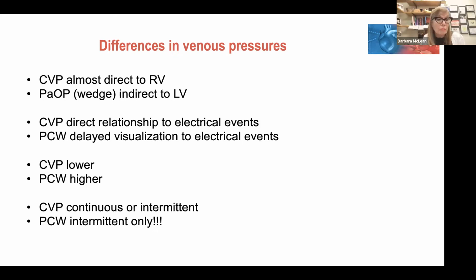If you walk into the room and you see something that no longer looks phasic, big systole, dicrotic notch, and diastole, but kind of these vacillating waveforms, first thing you do is make sure there are no air bubbles in the system. Second thing you do is make sure your pressure bag is at 300 millimeters of mercury. Flush, flush, flush. And not manually, only with your little pigtail, because you won't be able to flush much solution. And if that doesn't clear, you need to call a provider and say, my catheter is stuck in wedge.